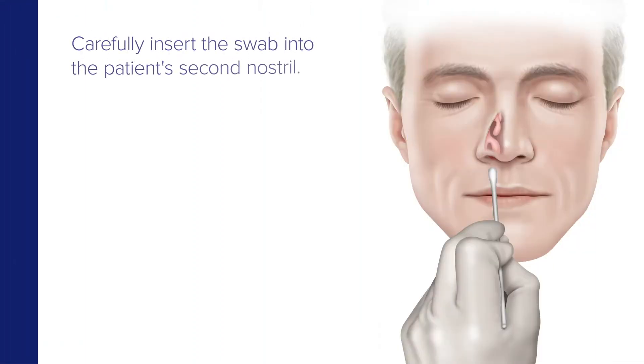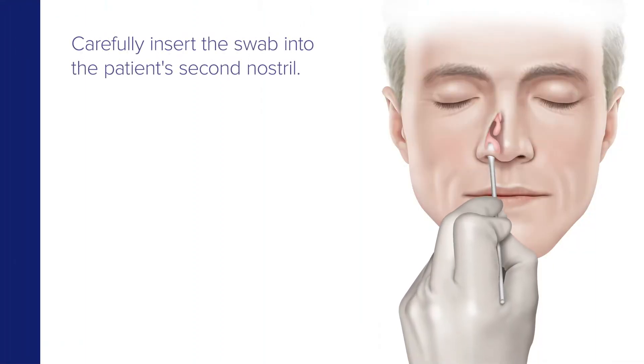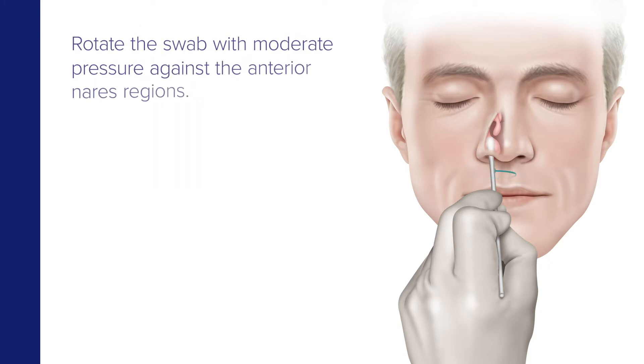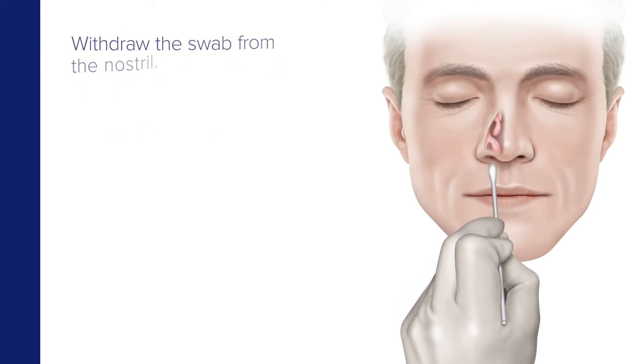Using the same swab, carefully insert it into the second nostril until resistance is met at the level of the turbinates, which again is one half to three quarters of an inch into the nostril. Next, rotate the swab with moderate pressure against the wall of the anterior nares region in a large circular path at least four times, which is about 10 to 15 seconds, then remove it from the nostril.